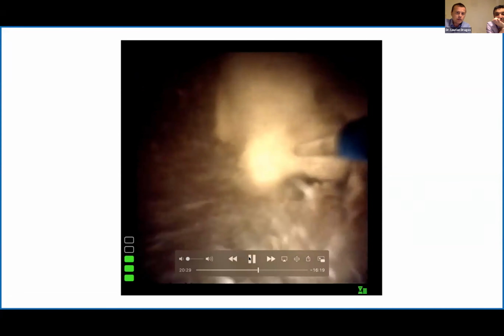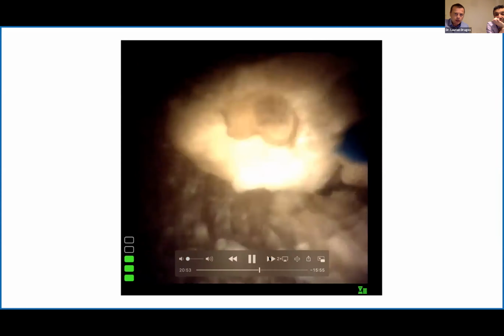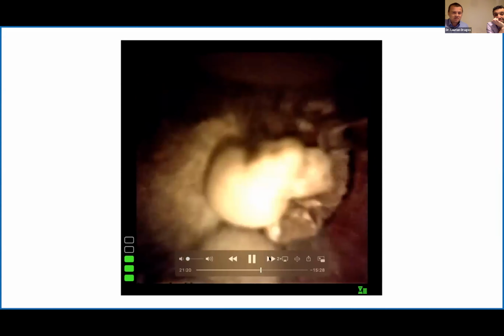For me, it was unexpectedly difficult, the flexible ureteroscopy part of this procedure, and you can see there's plenty of stones in there. I felt a bit frustrated. I was not very efficient. I will just speed things up a bit. Obviously, at some point I will stop lasering and we will start bringing this. I'll insert the basket and we'll start bringing the stones to Kasra to basically do something. I was feeling like I'm not advancing very much.